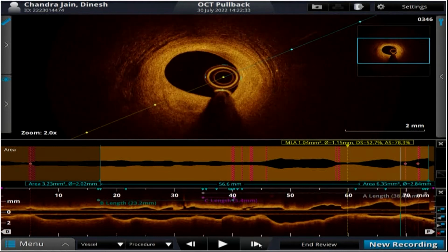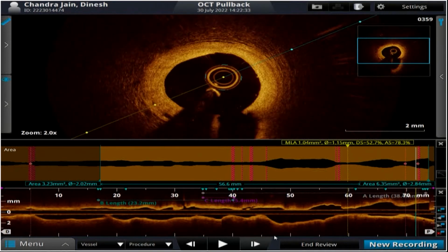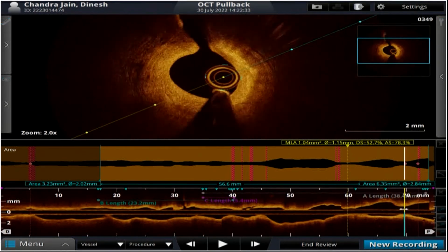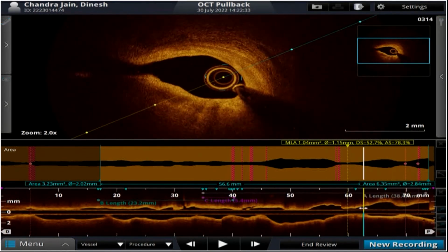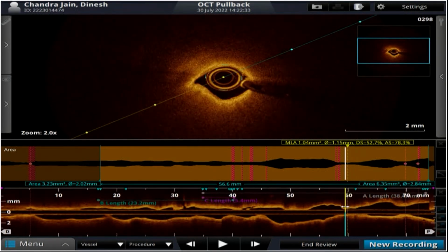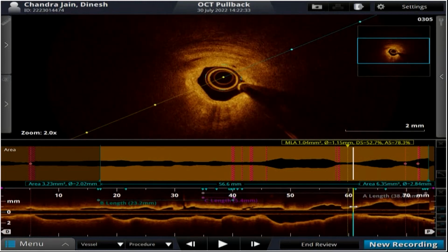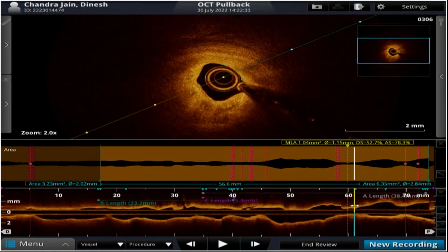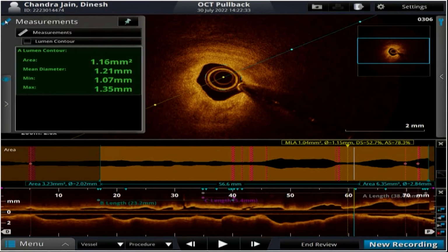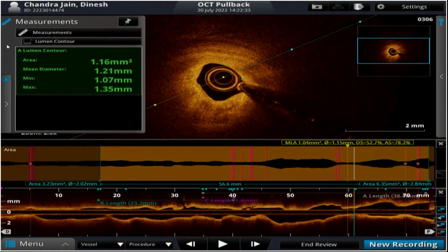So do you do OCT in all these patients, even if you have a creatinine of 2 point something? I think it's 2.4 or 2.3, and so you could have used. The point of the case was that we are doing OCT without contrast. I do not understand. This is saline. No, I understand that. Your first one, because of co-registration, you had to use a little contrast, and you must have mixed it with saline. But how would IVUS have worked in this place?